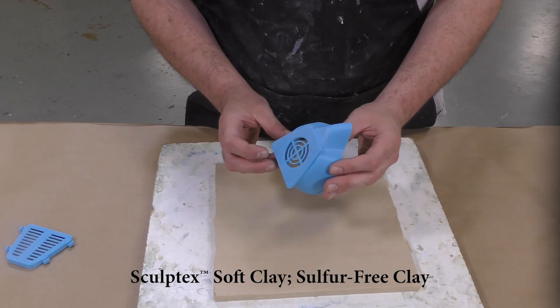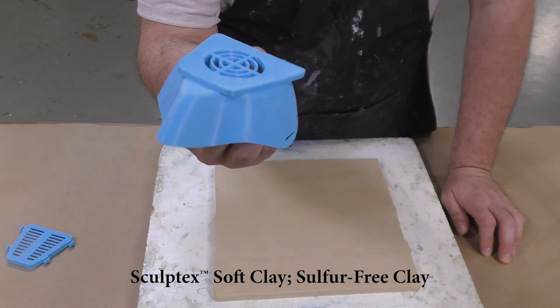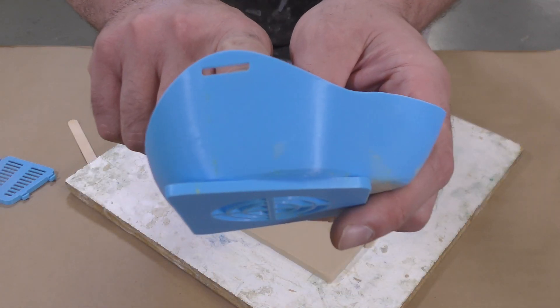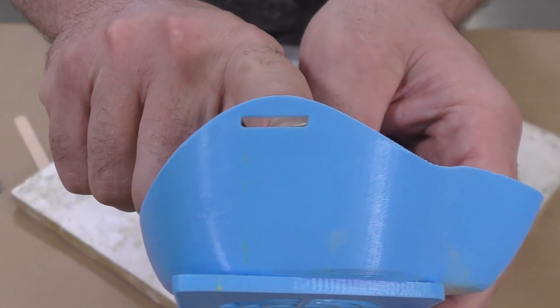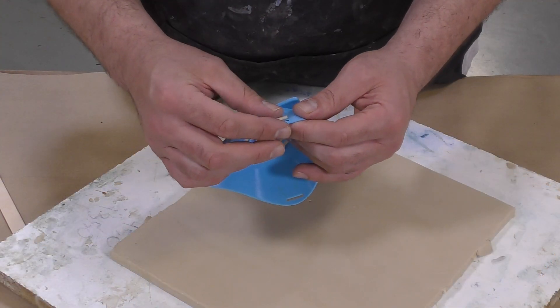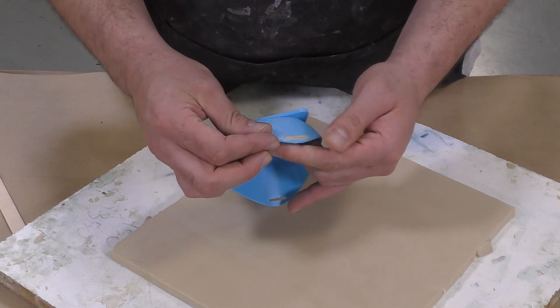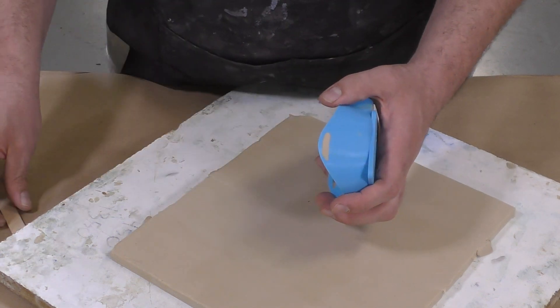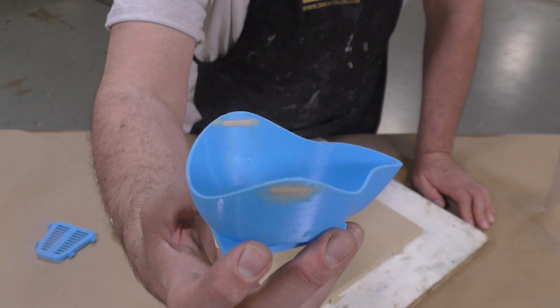We went ahead and 3D printed this model and now we're going to use it to make a mold so we can recreate more models. You always want to study the model first. I noticed these holes here for the straps, and we're going to get rid of these because they make the respirator useless. So we're going to plug them up with a little bit of Sculptix soft clay — this is sulfur-free oil-based clay, which is compatible with pretty much any platinum or tin-based silicone.